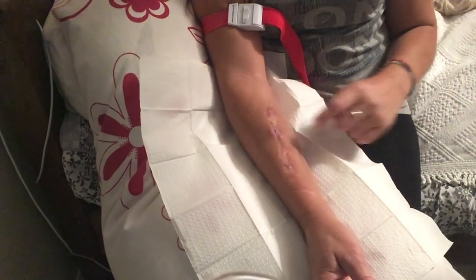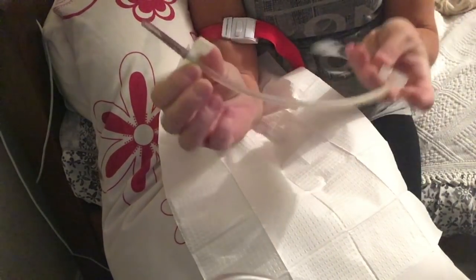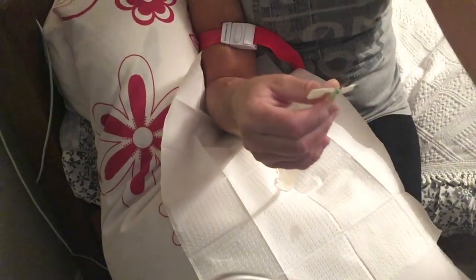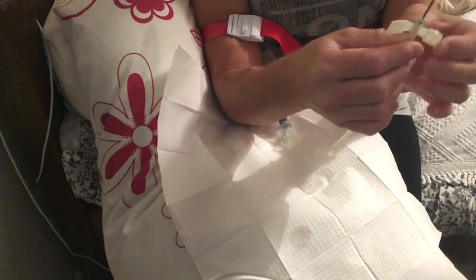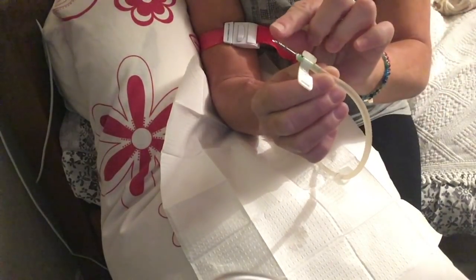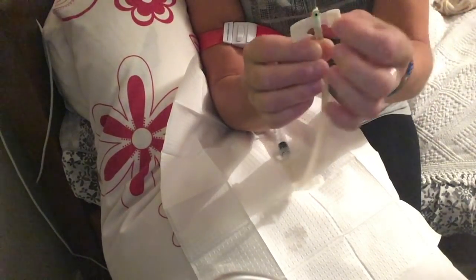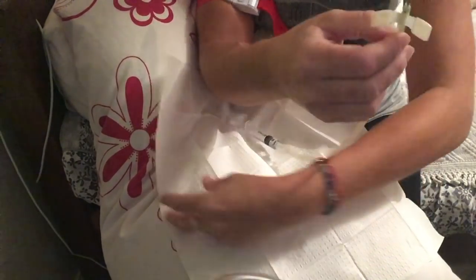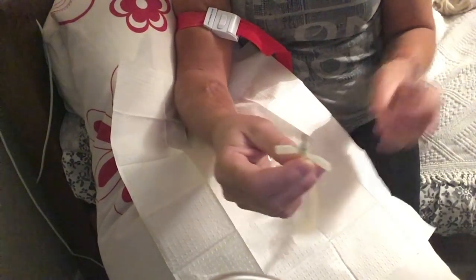I've already primed these with saline, so I'm just going to take the cap off that needle. I always needle with the flat side of the needle downwards — there's a black dot on the top. There are lots of different brands of needle, but you can rotate them around either way, whichever you prefer. Then I actually rotate it around once it's in my arm.